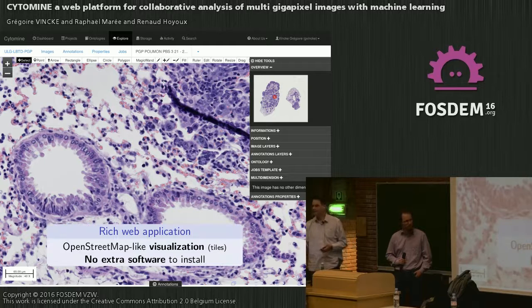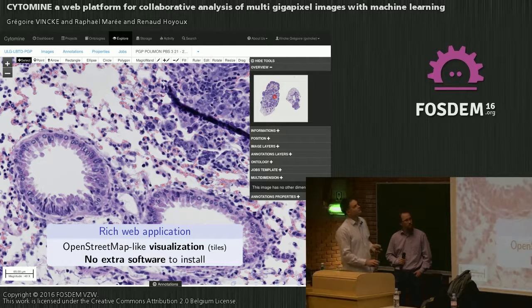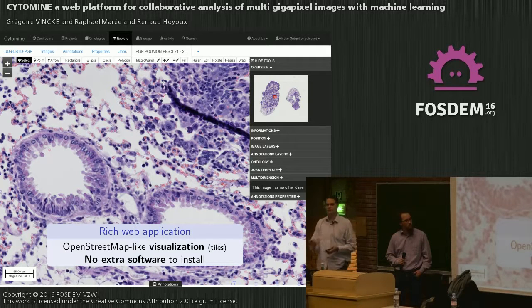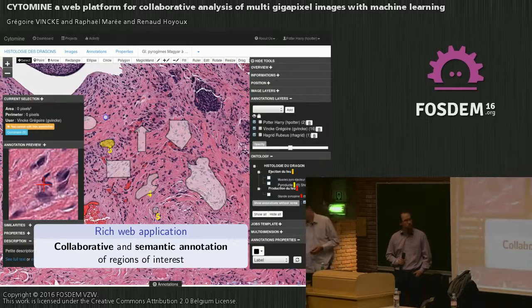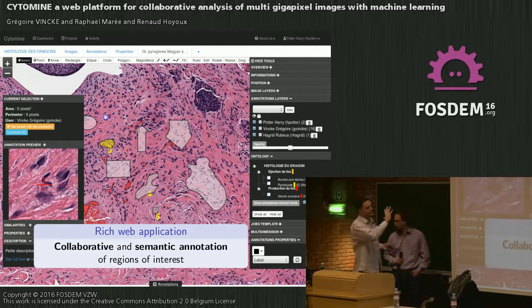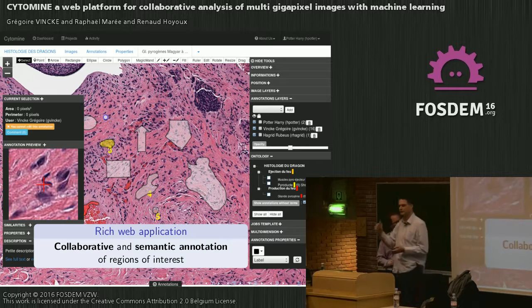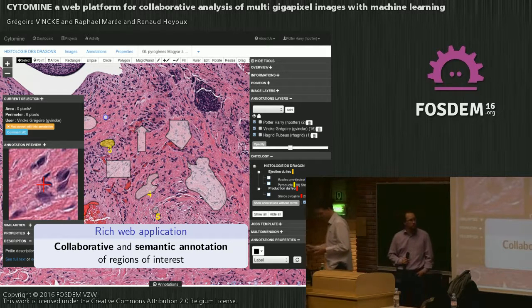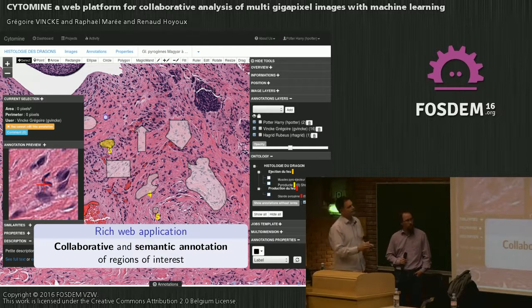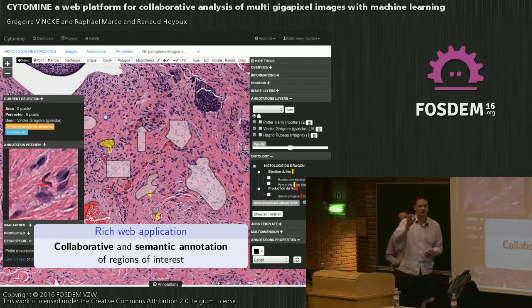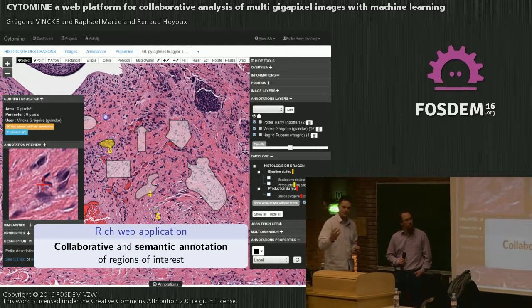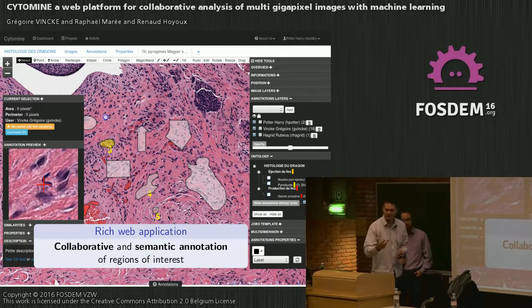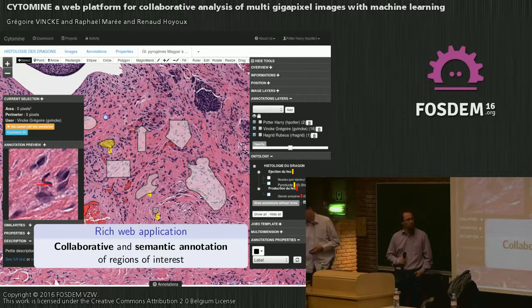When files are uploaded, you can set different collections called projects and open files in the browser directly. It's a tiled image technology — like OpenStreetMap — so it's quite lightweight for the client and needs no extra software installed, which is quite new in this area. Each user has a transparent layer over the images and can draw on it: points, circles, rectangles, arrows, or areas drawn by hand. The objective is to annotate structures inside the slides for study by humans or by computer. You can make semantic annotations by associating keywords, properties, or rich text with these annotations to share with colleagues or students.